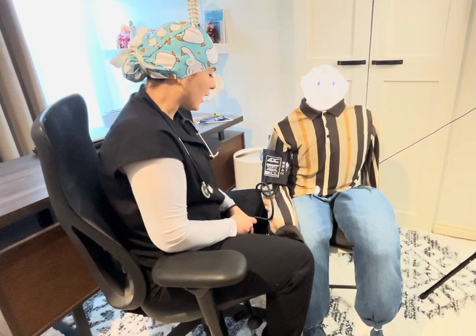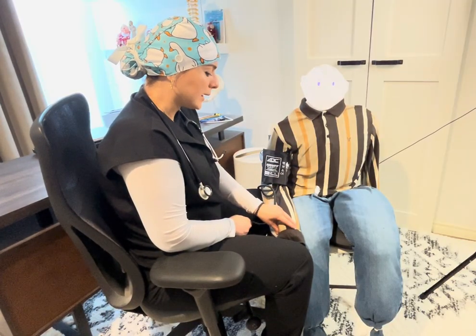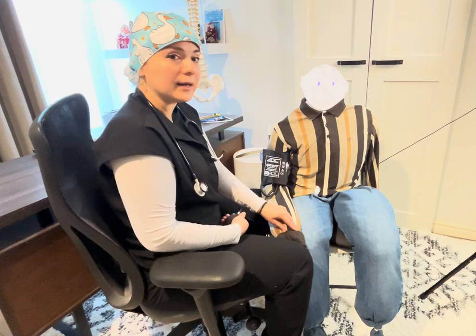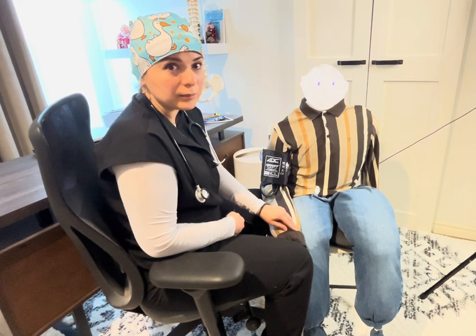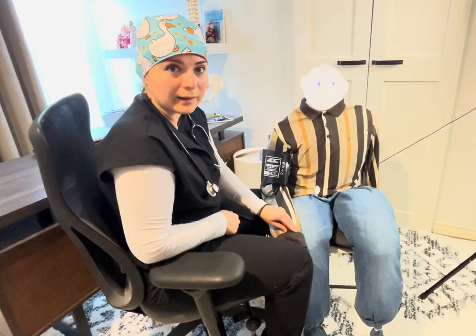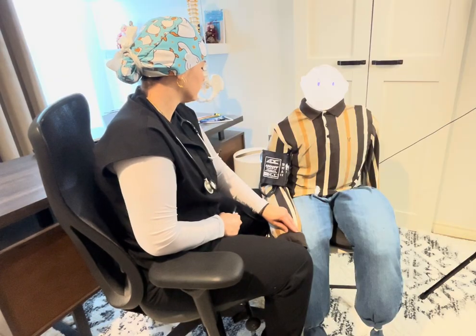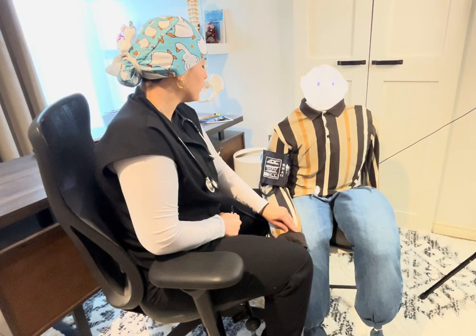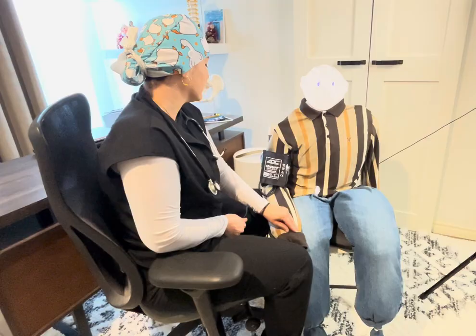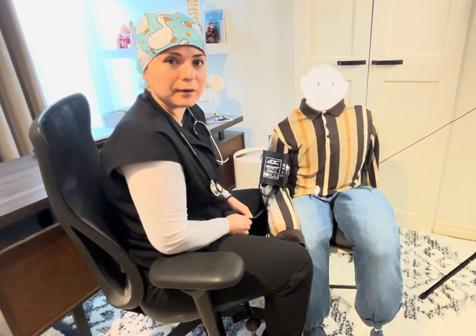To find the estimated systolic pressure, locate the radial pulse and palpate it, then inflate the cuff. At the point when you no longer feel the pulse — when it obliterates — look at the gauge and remember that number. For example, let's say at 100 mmHg the pulse is no longer palpable. Go ahead and deflate the cuff at a rate of 3 mmHg per second.